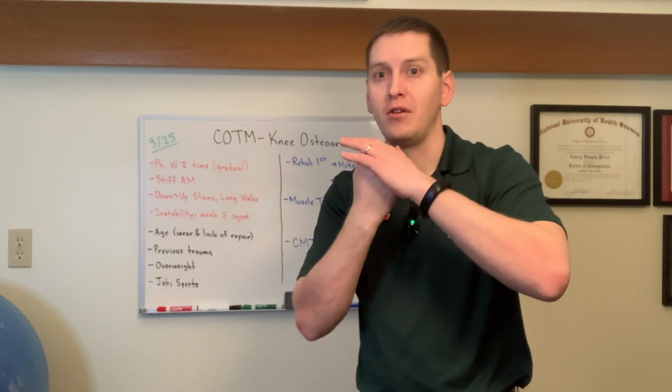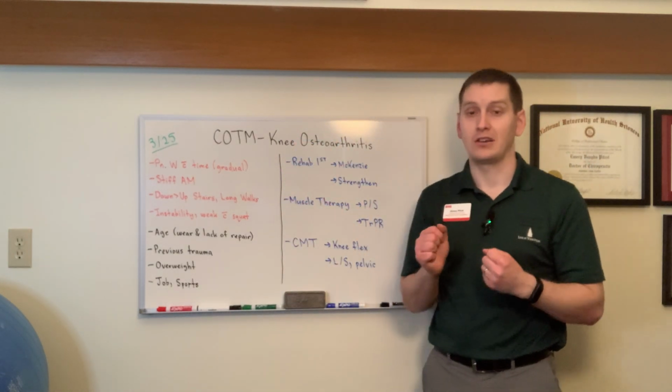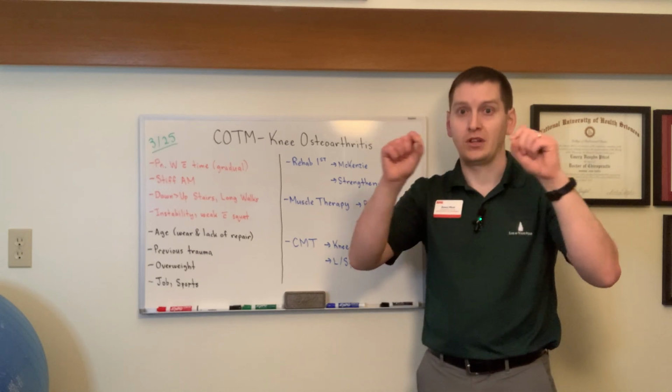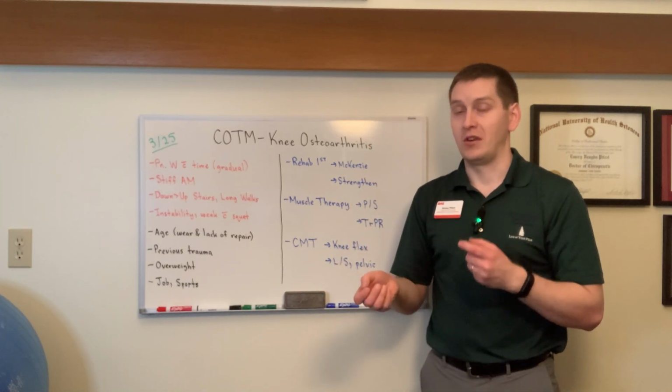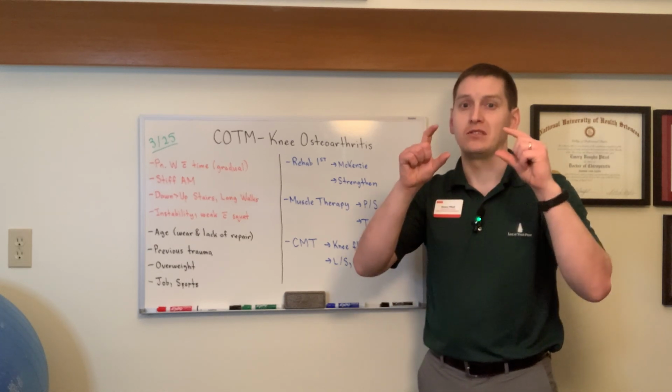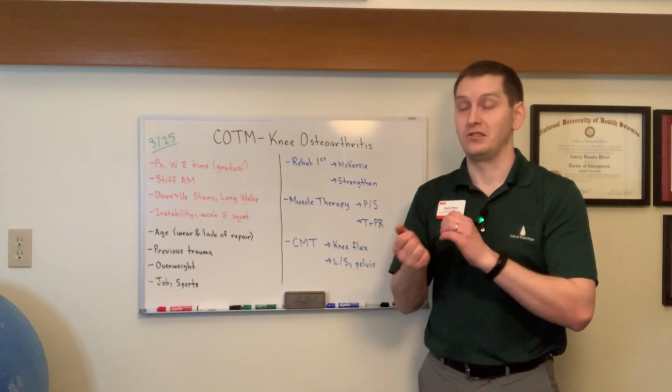And as that bone on bone happens, there are three big changes that are often seen on x-ray. The bony joint line will get a lot more white, which is known as becoming sclerotic. If there's enough of that bone on bone, then you'll actually get some bony overgrowth on the edges, which are called bone spurs or osteophytes.